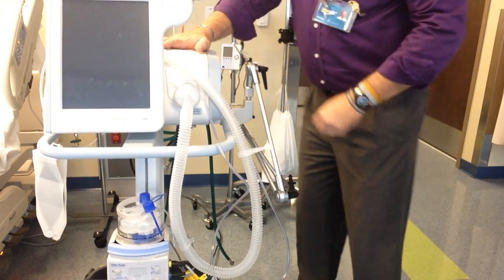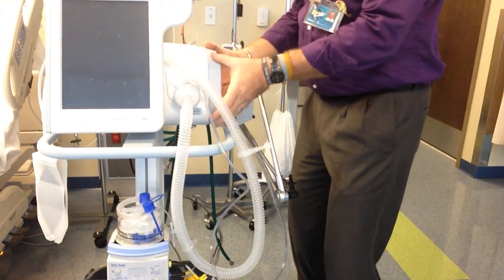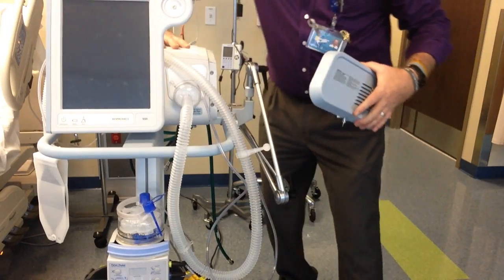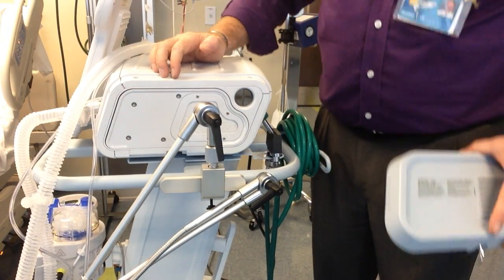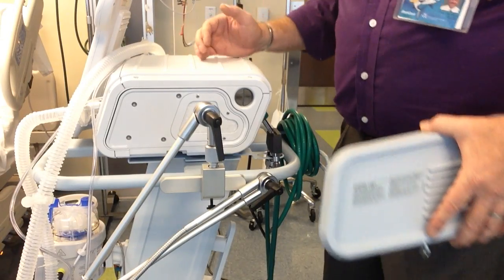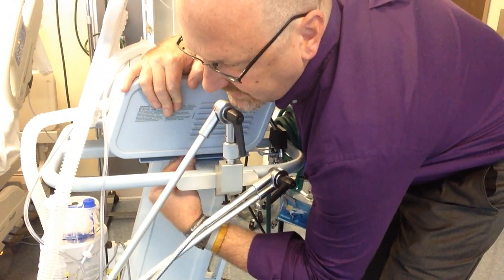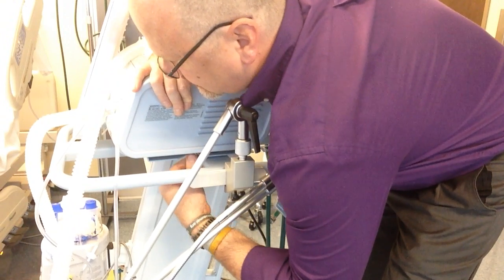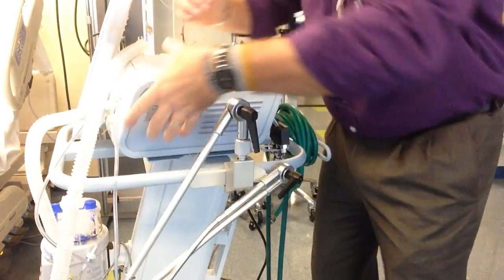Another thing that you want to check, this would be before you even go to the patient's room, is to make sure the patient's filter is clean. There's a little twist lock down here. Open it. This side lifts off. If you see there are vents here, this is where the air goes in that the patient will be breathing. And there is a filter on the side, right here. We do not really replace it. If it is really, really dirty, your department or bioengineering will need to replace it and fix it. But this is something that we just need to check between patients. And this goes back in, it lines up, and it takes a little bit, goes up, and you'll twist it and lock it in place. There, locked. And it does not come off.